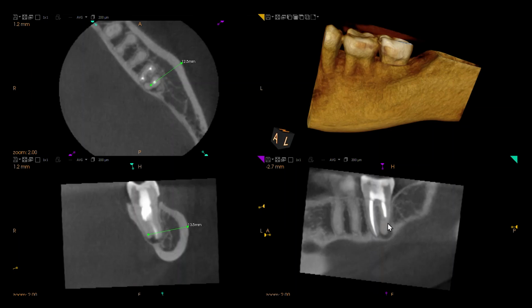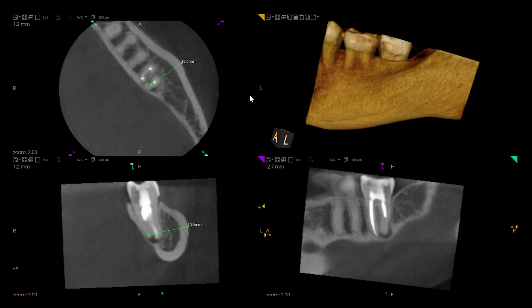So all in all, when we look at this radiolucency in a patient that is completely asymptomatic, there's a lot of motivation to do nothing, especially in the case where the patient has been asymptomatic since the case has been completed. It's nice to have some films to compare from the initial endodontic treatment, but in this case, we were not able to have that. So in the case of this young patient, she decided that she wanted no treatment, and we will leave it and bring her back annually to see if the area enlarges or if she has symptoms.